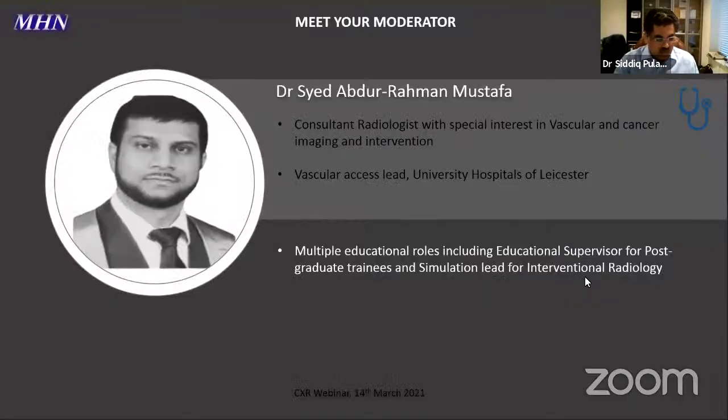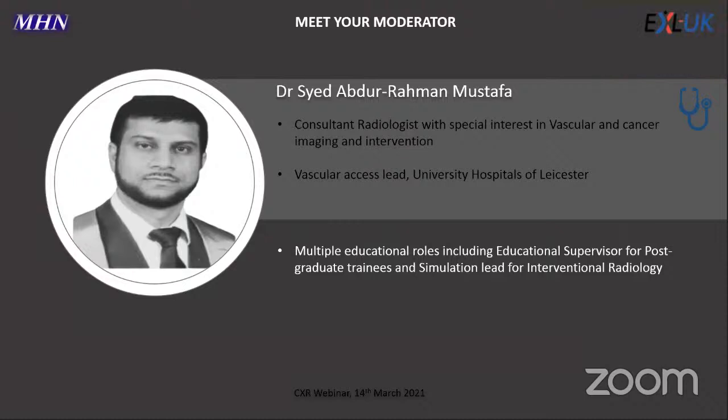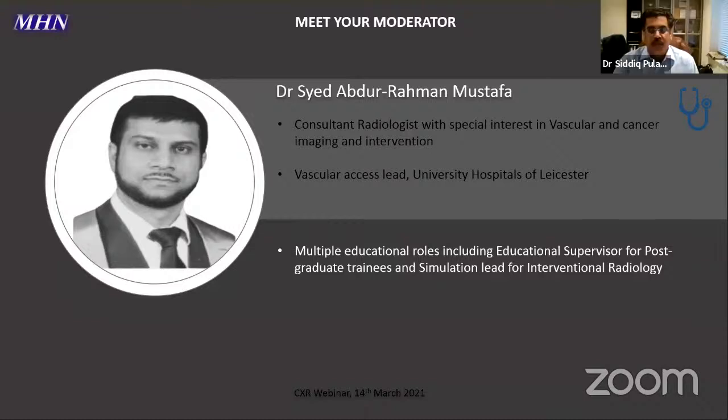So we have to see this X-ray only as one point in the whole journey of a patient. Now we can see a few clinical cases, and how the clinical and radiological become one in managing a patient. We have a few eminent speakers who will be talking about different aspects of it. With me, I also have Dr. Rahman, who is a good friend of mine. I have known him for a long time. He's an interventional radiologist with an interest in vascular imaging at Leicester Hospital. He will be helping me with the question and answer session at the end.